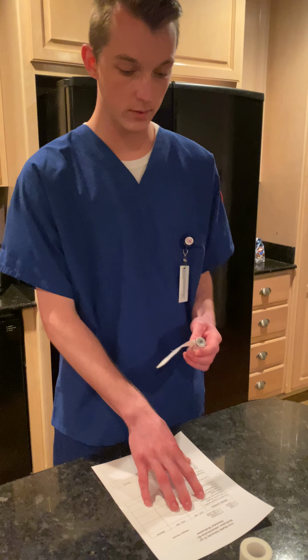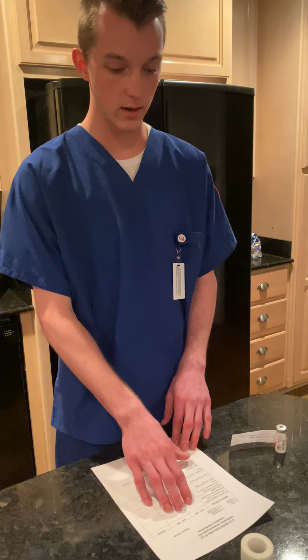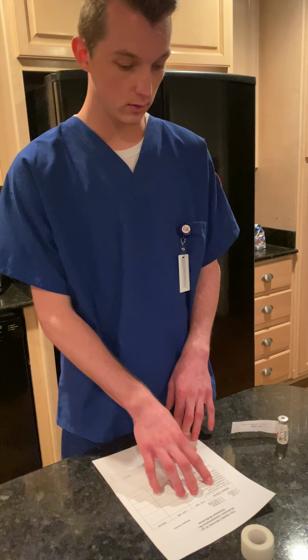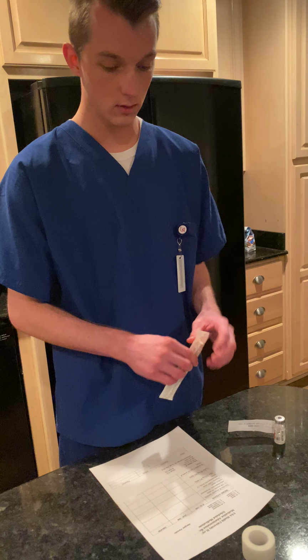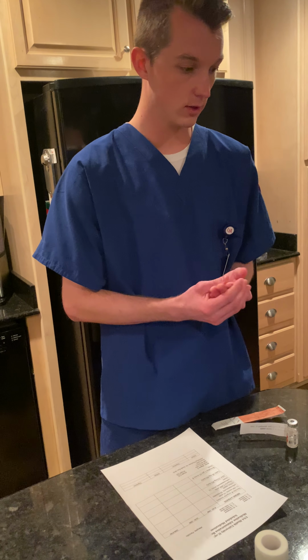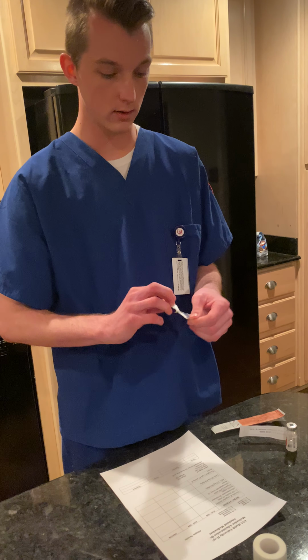The medication is going to be given 30 minutes before meals, and he has not had the medication administered yet. And it is done subcutaneously with 10 units, so I'll select the correct syringe, which is the insulin syringe. And then I will perform hand hygiene and clean off the top of the vial with an alcohol pad.